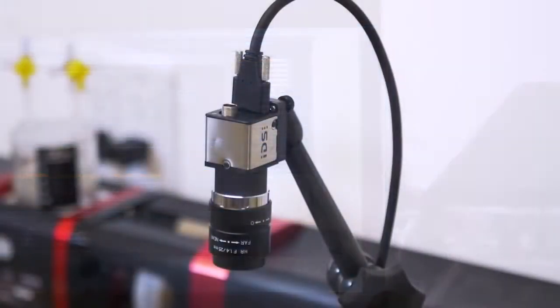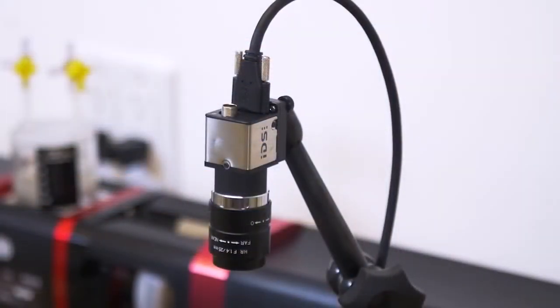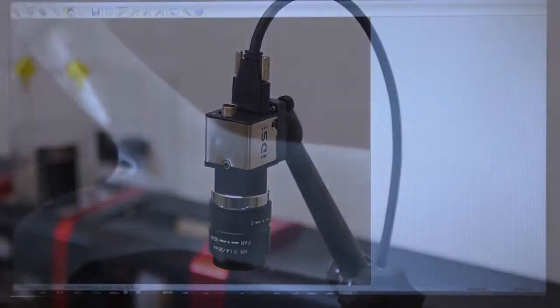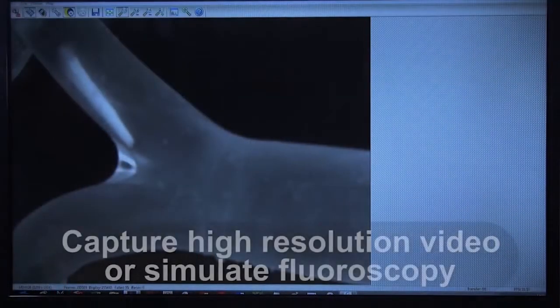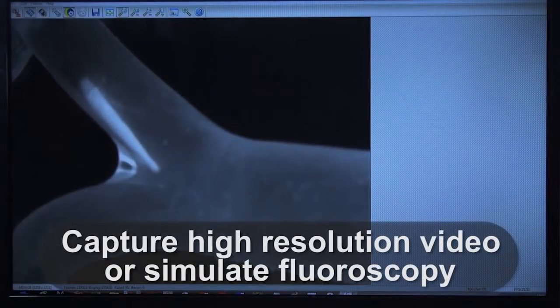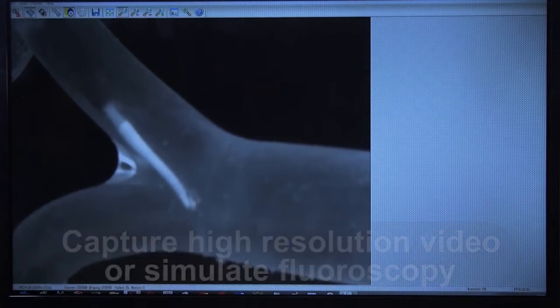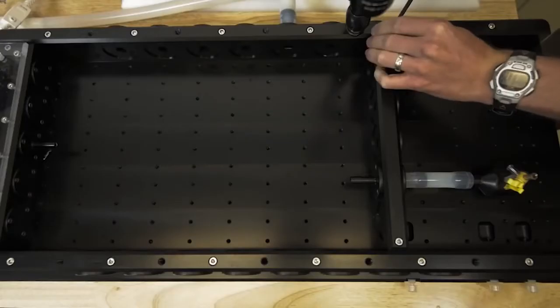A camera can capture high-resolution imagery of positioning and deployment. It can also be used to simulate fluoroscopy without the use of an expensive cath lab.